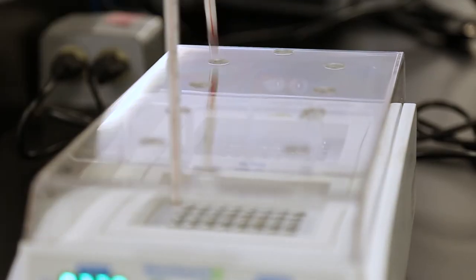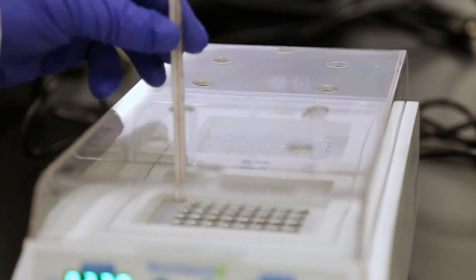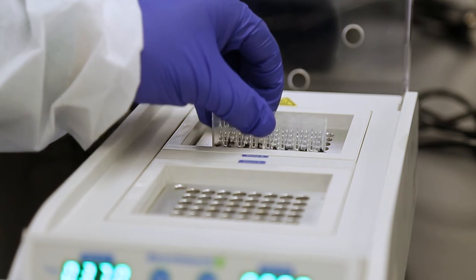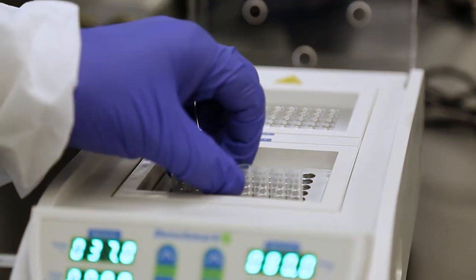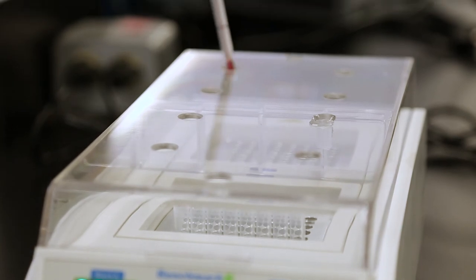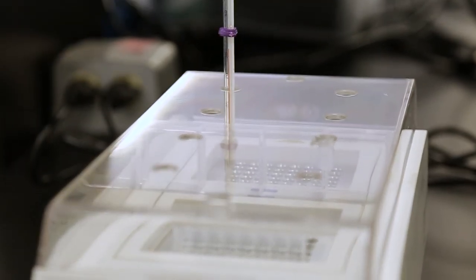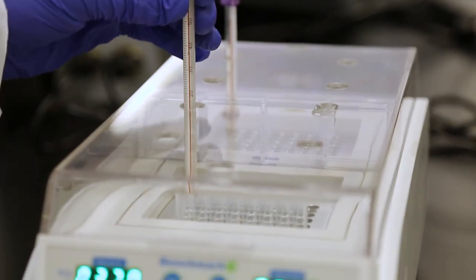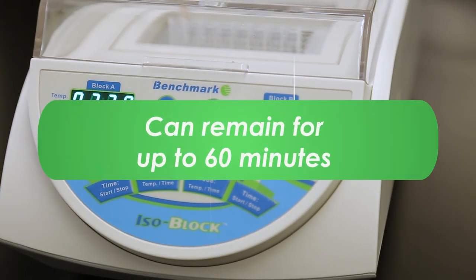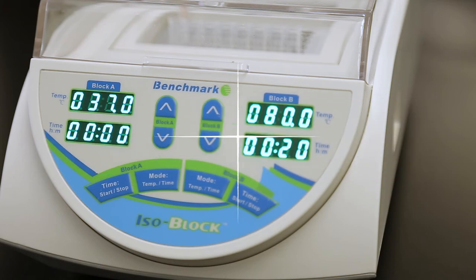After the 10-minute incubation is complete, remove the thermometers if you placed them back in and immediately open the lid and move the cluster tubes to the 80 degrees Celsius block. Close the lid and if you like return the thermometers. Then start the block B timer you set to 20 minutes. Note, the cluster tubes can remain in this block for up to 60 minutes.